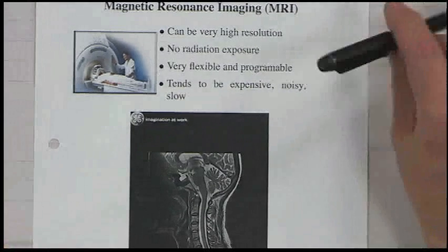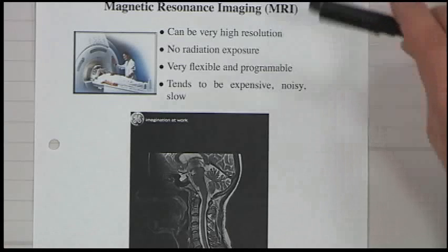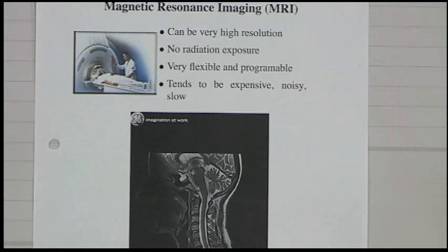Okay, so MR has some advantages and disadvantages compared to CT. You'd say, well, why don't they just get rid of one and just do one instead of both? Well, they each have strengths and weaknesses, so neither can completely replace the other. Although there are some things that they can both do, and they compete for basically healthcare dollars.